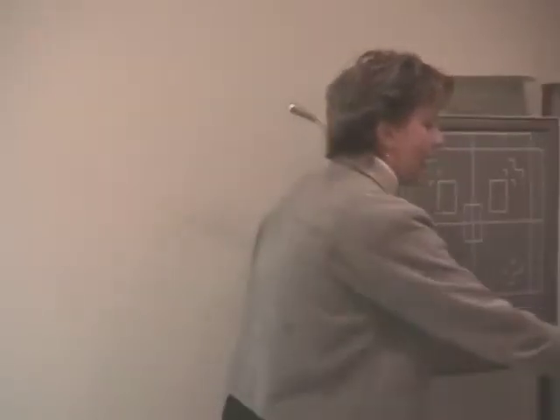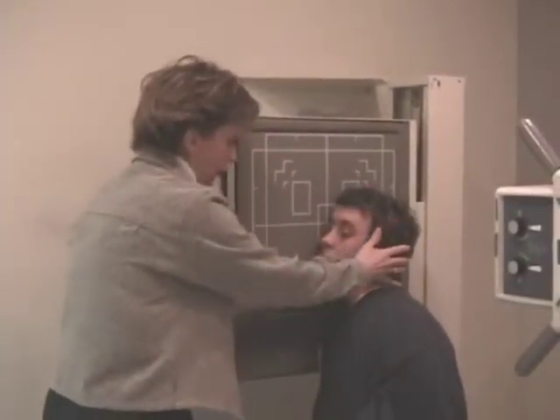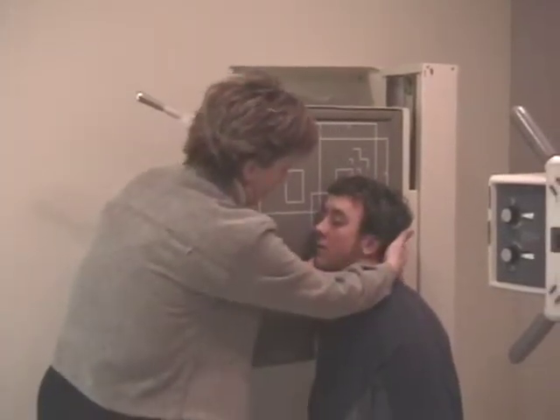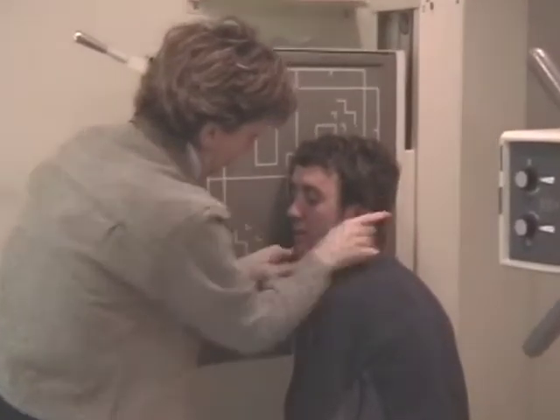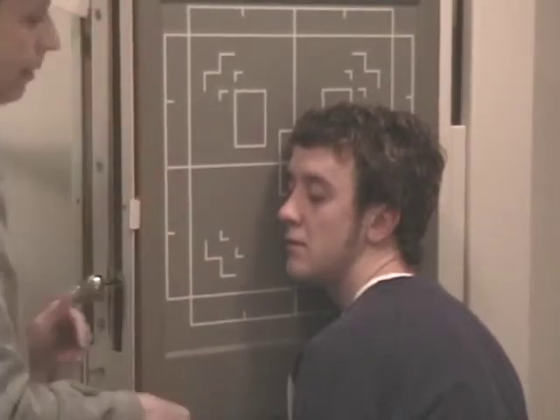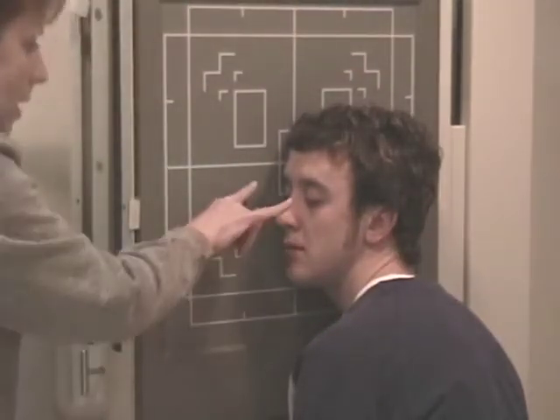We're going to do our lateral next. It would be the logical move. Infraorbital meatal line should be parallel to this axis. That'll keep the patient from looking too far down or looking up in the air. So the infraorbital meatal line parallel to this axis, that plane.